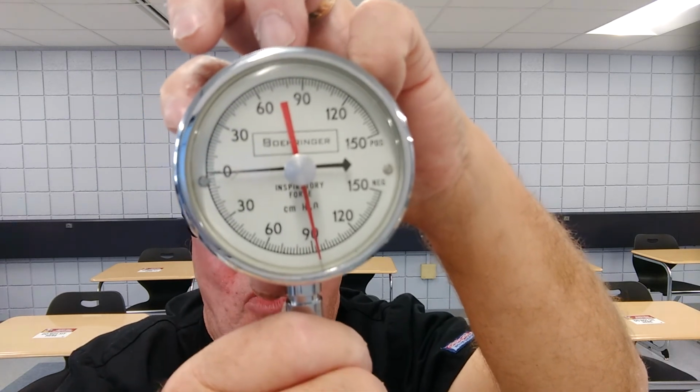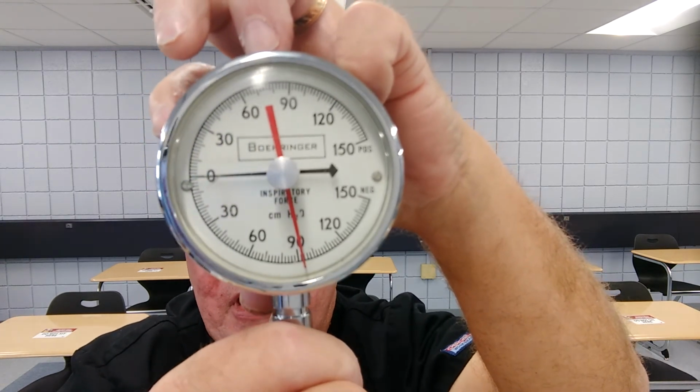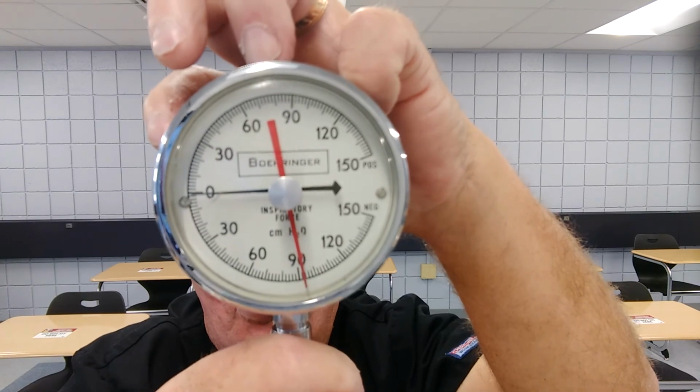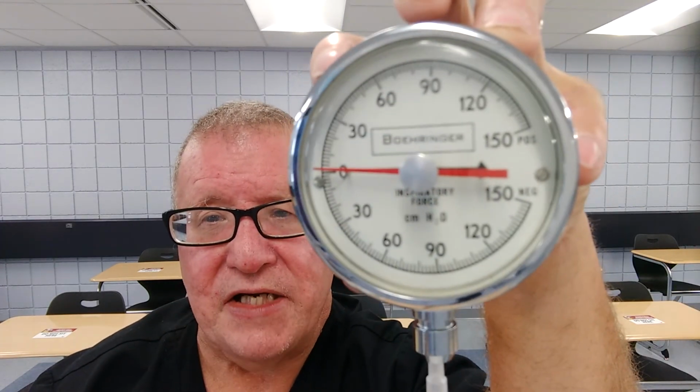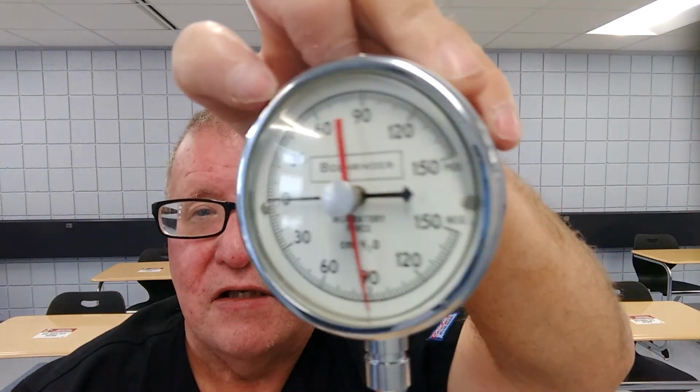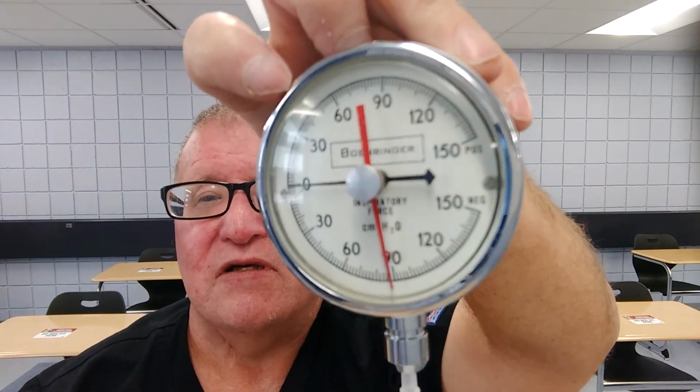Again, that's normal, all right? For most people, you can get around that number, but what you're looking for is minus 20. Again, reset the red needle back up to the black needle where it is. Have the patient exhale all the way, suck in. Again, the red needle moves up to the number. Then you put them back on the ventilator, you read the number, and that's what's recorded.